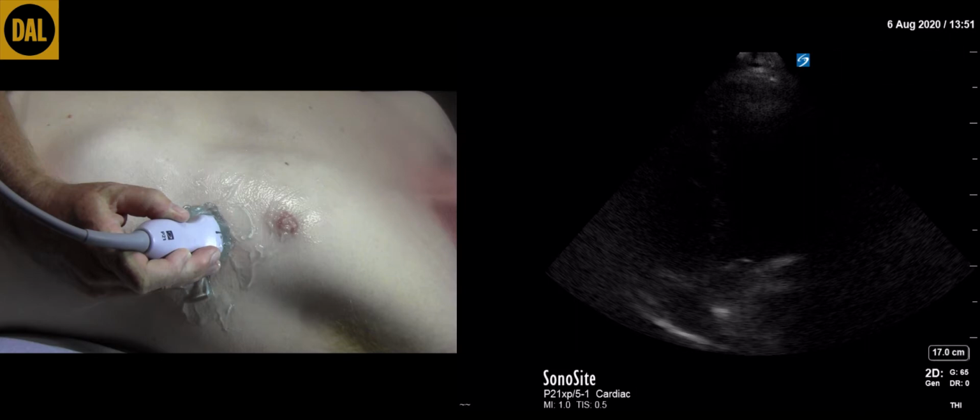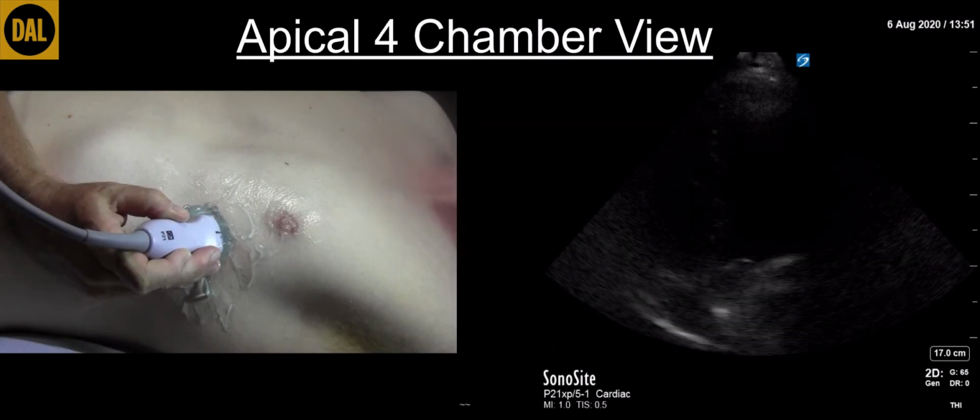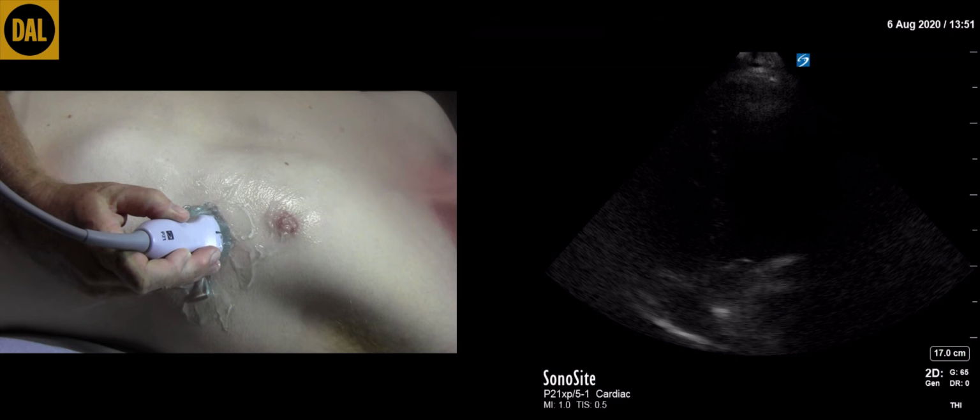The depth should be set to approximately 20 centimeters. If, as is usually the case, this scan has been preceded by the parasternal short axis view, increasing the depth to 20 centimeters will be required. Greater or smaller depths may be required depending on body habitus.